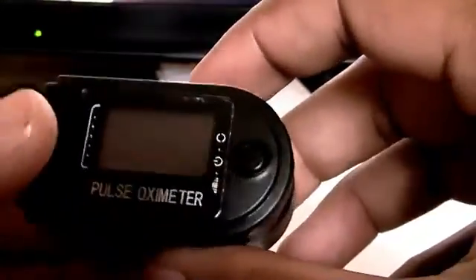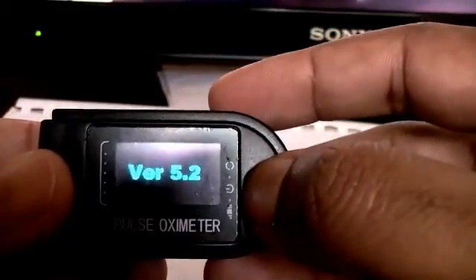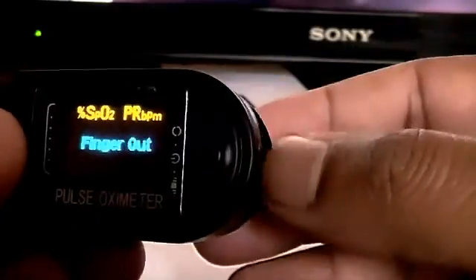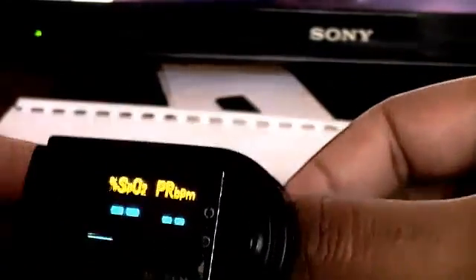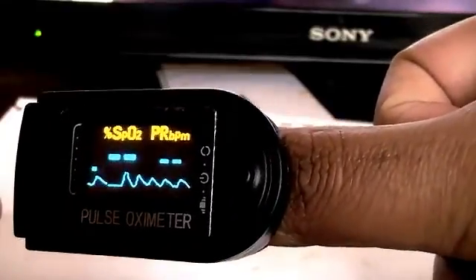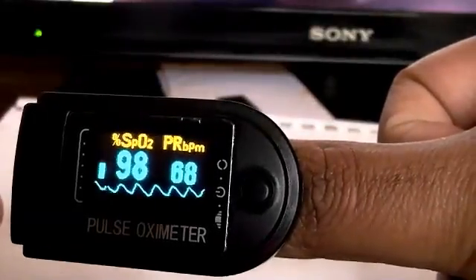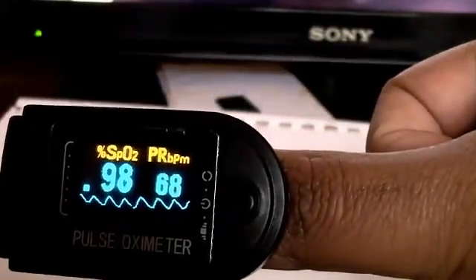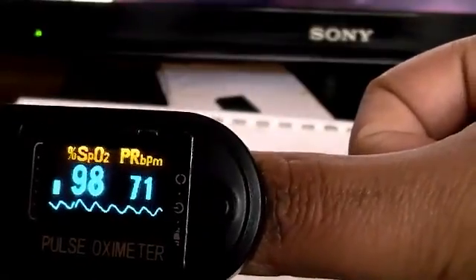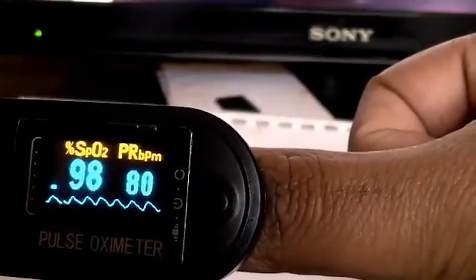Very nice. Alright, finger out — let's put my finger in. So my saturation, oxygen saturation is 98%. My heartbeat is... wow, it's racing — 80 bpm.